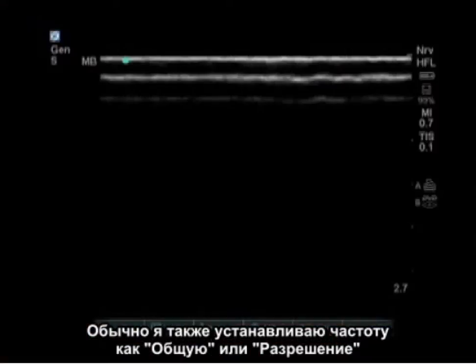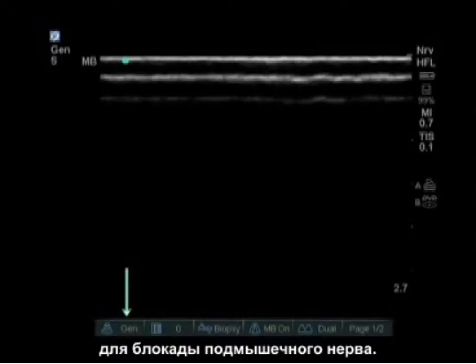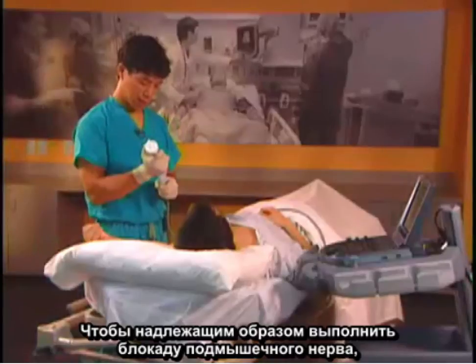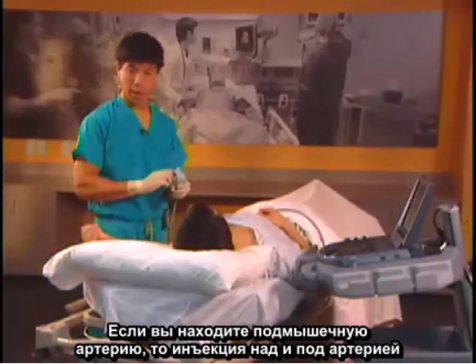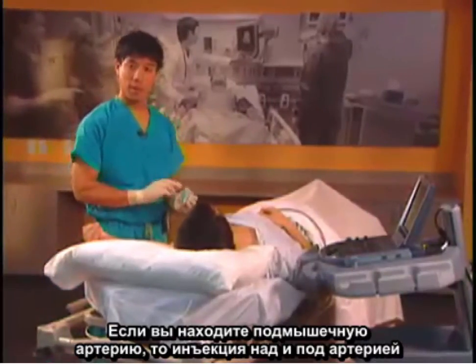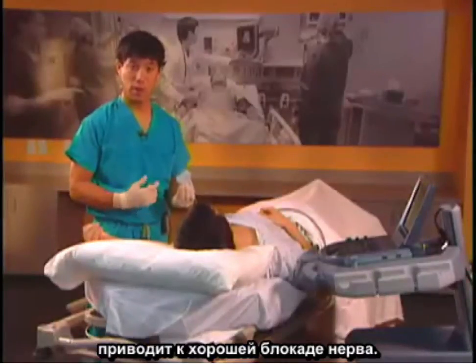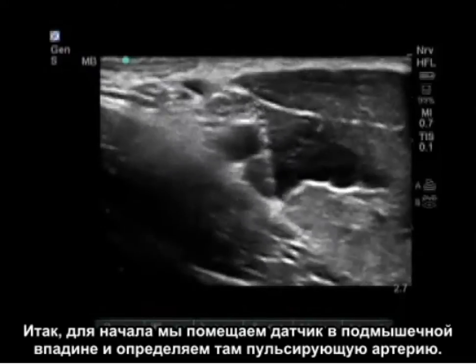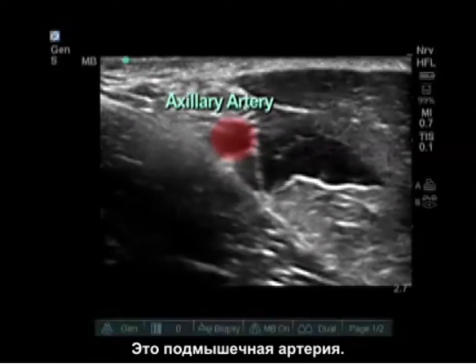I also set the frequency settings to general or resolution for the axillary nerve block. To do a properly executed axillary nerve block, identification of the artery and vein is important. If you find the artery, injection below and above the axillary artery usually results in a good nerve block. We initially place the probe in the axilla and identify a pulsating artery — this is your axillary artery.